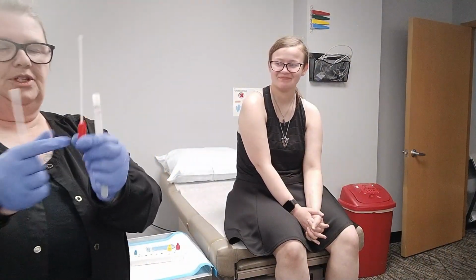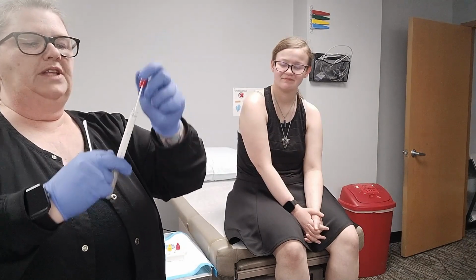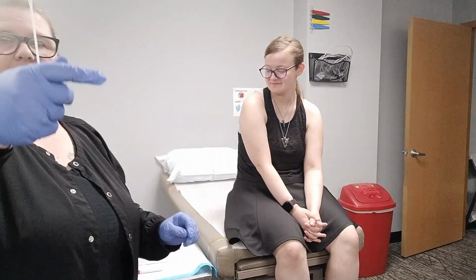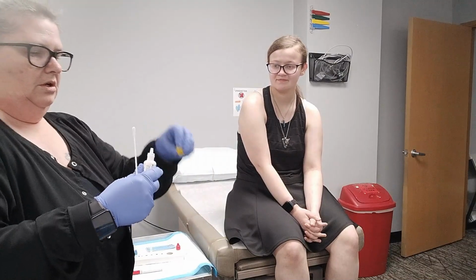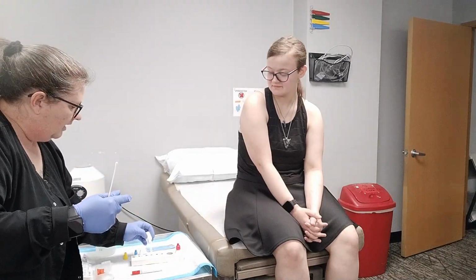The red top swab that's going to the lab is going to go right into here. We're going to take the lid off of the tube, put that in there and secure that. We'll label that with her information here in a moment. This is going to go into our test tube. Now we could have done this ahead of time. You can do it during, it really doesn't matter.